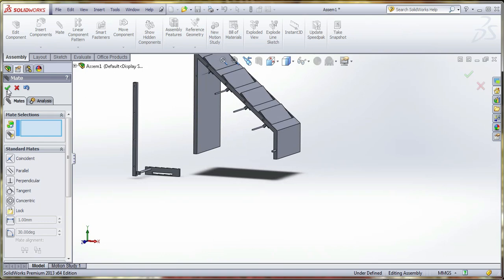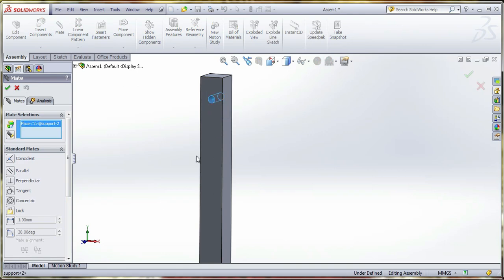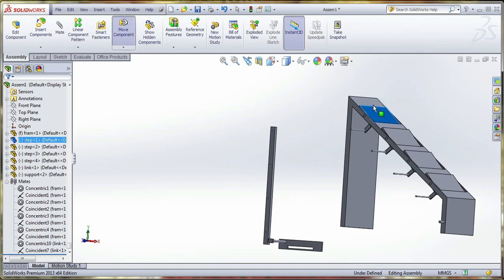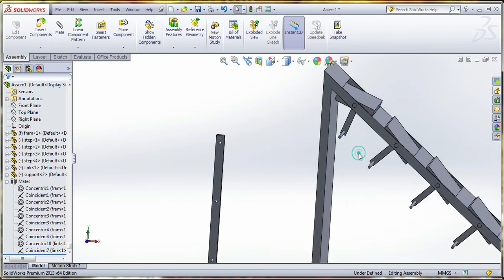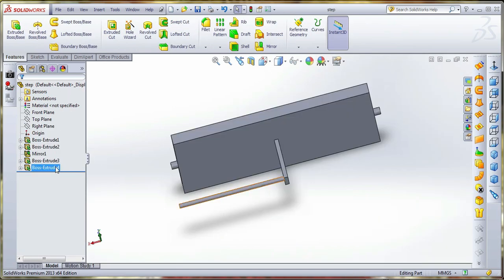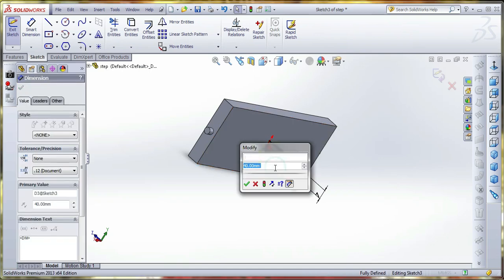Okay, we're going to fix this inner surface too. The pin inner surface, just left click and drag, and automatically it should move based on the constraints. I want to change the plate thickness, plate length. It should be minimized up to 35.